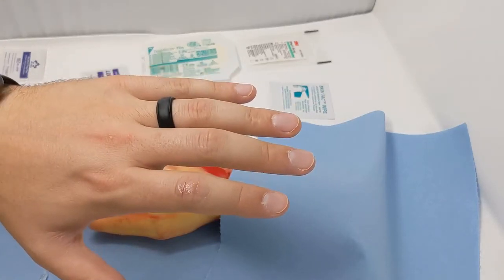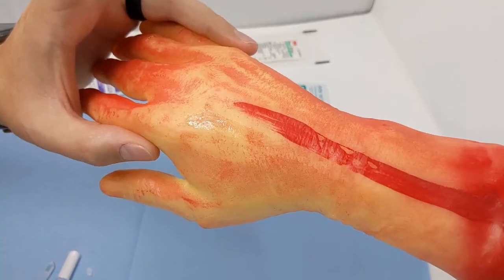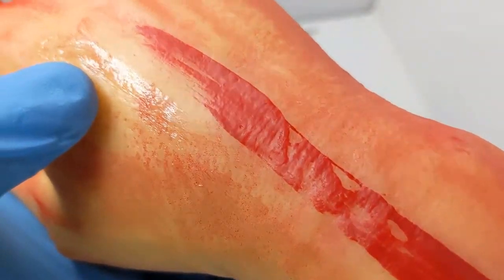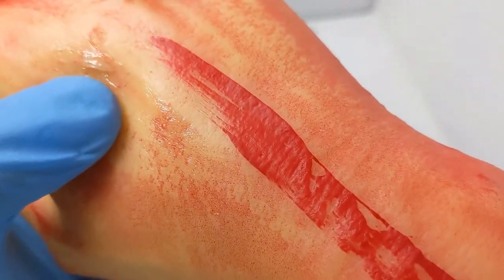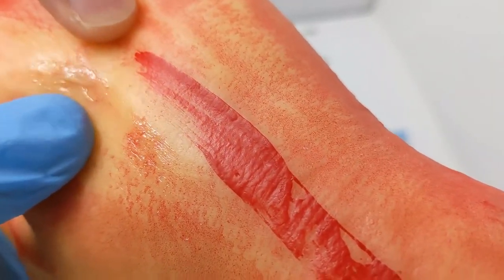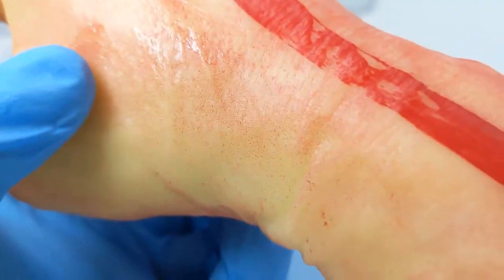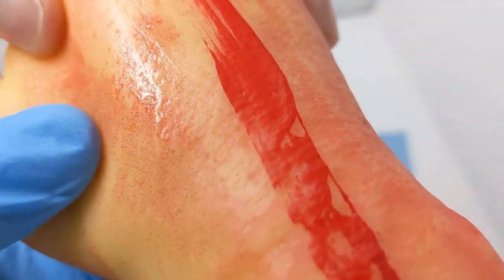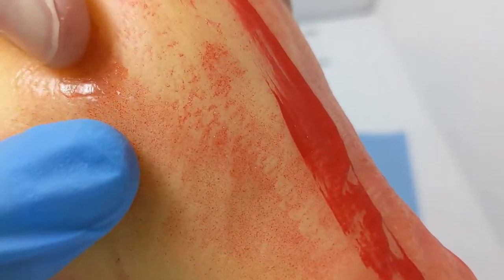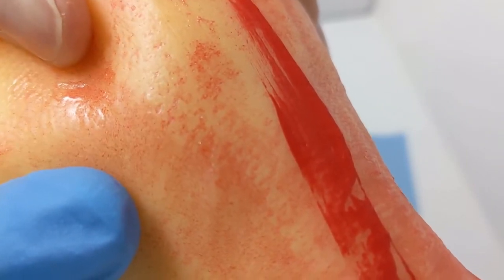I'm going to stop the video here and play another one when we test the elasticity and hold of these glues. Both the glues have dried. This is really interesting. That Liquid Skin actually doesn't seem to have closed the wound at all. It hasn't really dried well, and it's been on for a good minute longer, actually two minutes longer. It's still quite wet to the touch and didn't really close that skin at all. The Glue Stitch though is super bonded. That little wound there won't open up at all. It's completely closed. This dried really quick in about a minute.